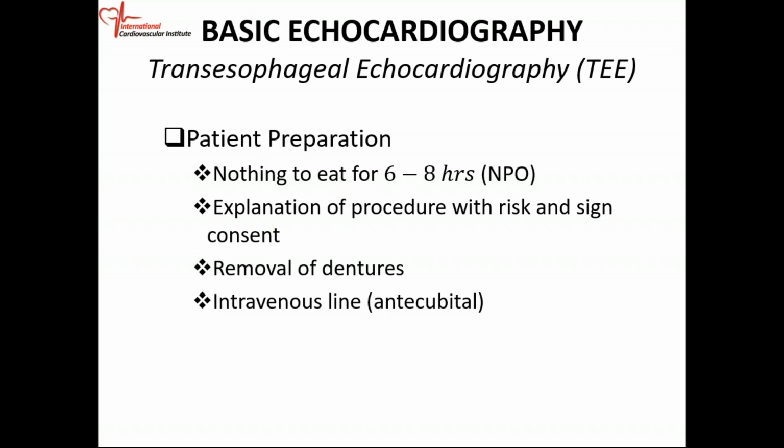That wastes time. If you're going to do a transesophageal echo and the patient has a CVA, a stroke, then a saline contrast study is one of the things you're going to do. So make sure that there's a large IV line in the antecubital area, so that when the patient gets to the procedure room, you don't have to be trying to put up a line to do this procedure.